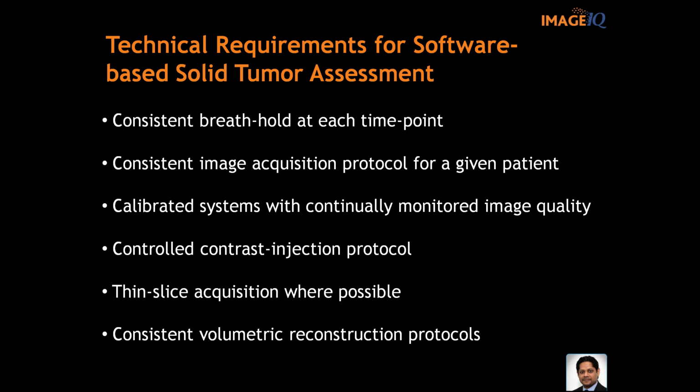That obviously can be an issue if specific sites and IRBs require low dose scanning where you're scanning patients quite a few times. But wherever you can, try to do the highest resolution. Try to have a consistent reconstruction protocol. Once you acquire your scan, you can reconstruct your data as a smooth volume or a high contrast volume, and that's all going to affect how your software performs.